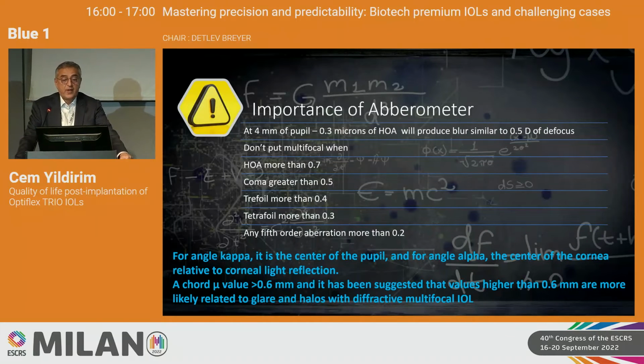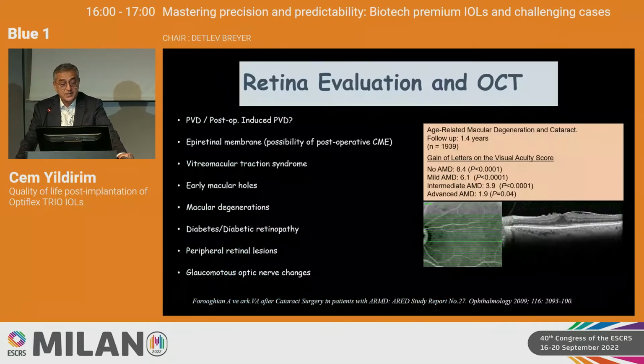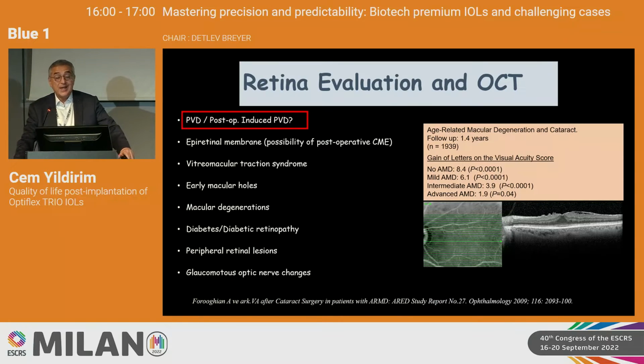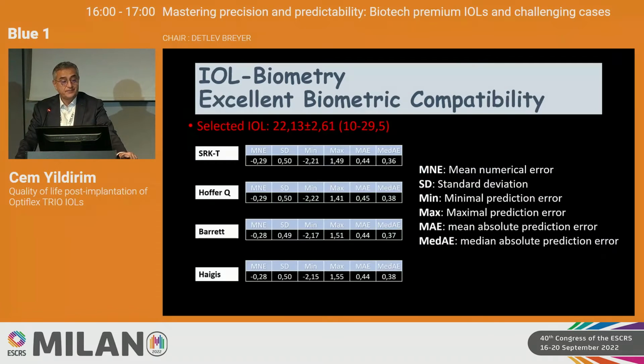The importance of the aberrometer is another issue for trifocal IOLs. Of course, you have to have a good pre-op retina evaluation with OCT, and especially pre-op PVD and post-op induced PVD are a remarkable consideration for following up patients with trifocal IOLs.